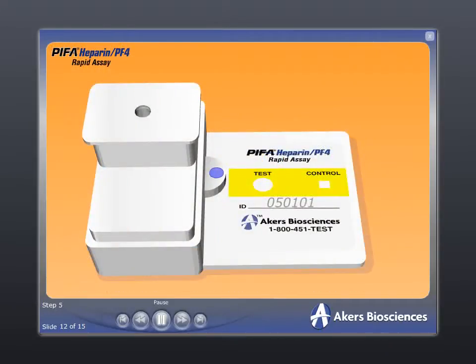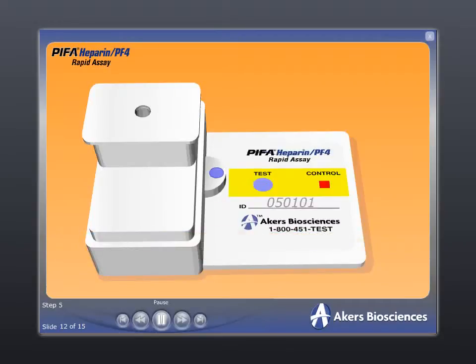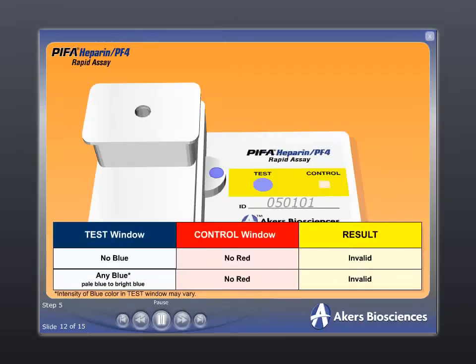If the test window is void of any blue color, the sample is reactive and the patient has tested positive for heparin platelet factor IV antibodies. If the test window has any blue color, the sample is non-reactive and the patient has tested negative for heparin platelet factor IV antibodies. Please note that if a red color fails to appear in the device control window, the test result is invalid.